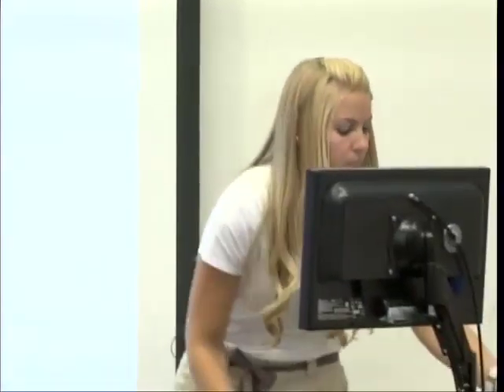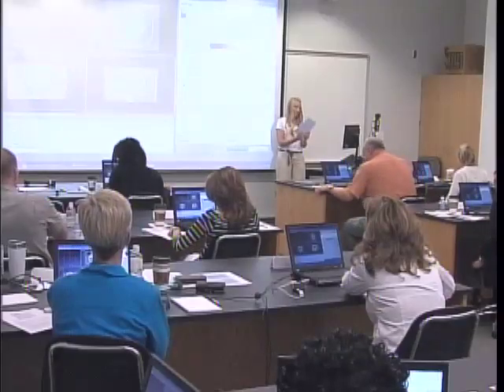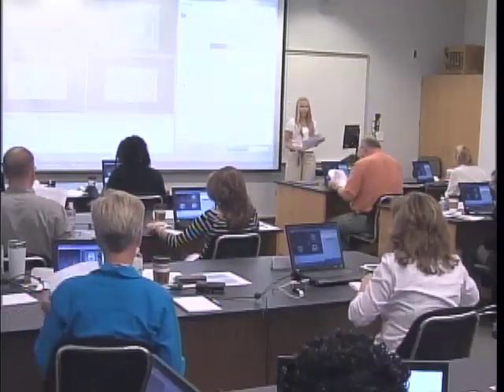Normally there's some user interpretation in the segmentation process, but we eliminated that by doing this next step, which is thresholding. So this will be on your page 6, in the very middle, I'm sorry, that says to proceed with the segmentation.